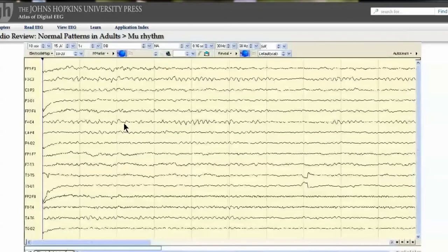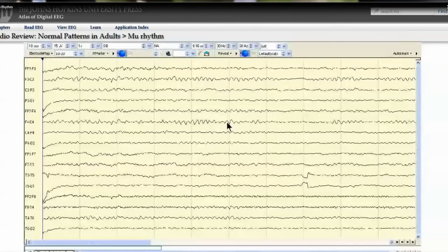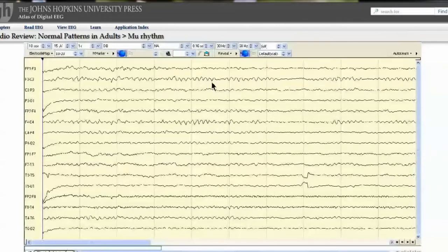Brief segment. We use an antero-posterior montage, parasagittal over temporal. With the black arrow, I'm demonstrating a frequency at about 8.5 cycles per second, or 8.5 Hertz. As you can see, it is present in this case bilaterally. This is in the alpha frequency, but in fact, this burst of alpha frequency is not over the occipital region and therefore does not represent the alpha rhythm. In effect, this is not the posterior basic waking frequency.